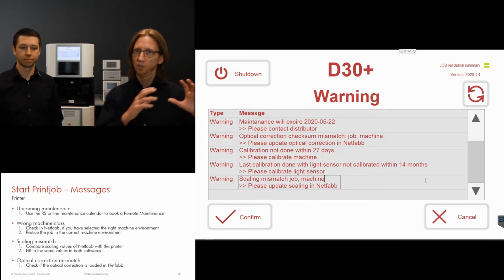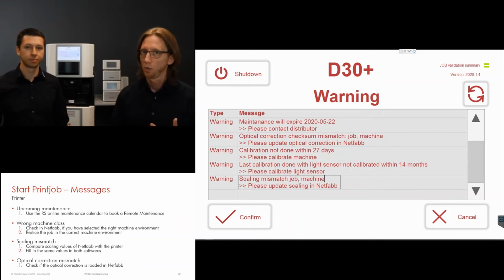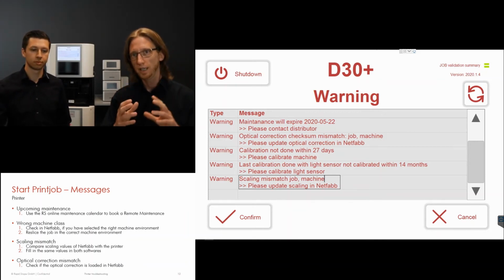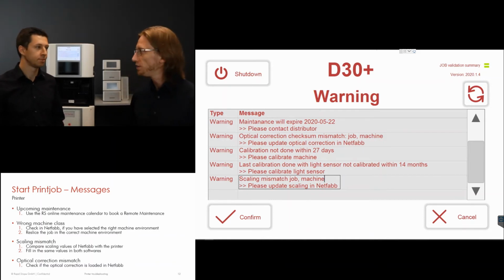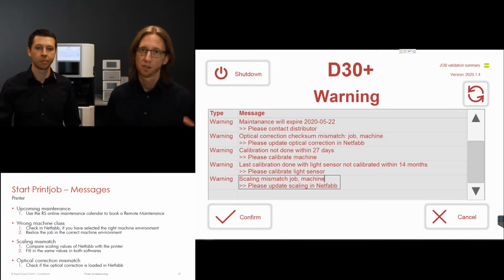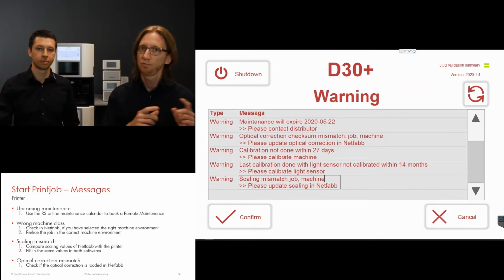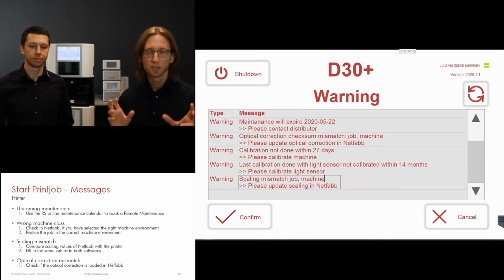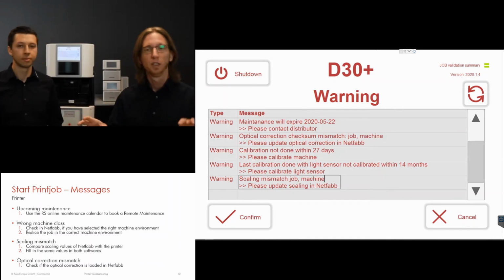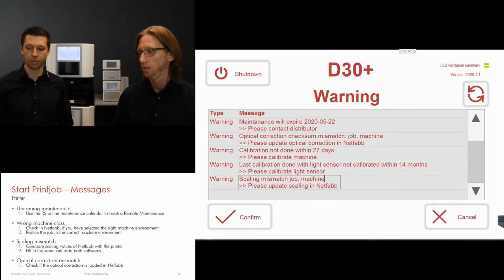As you all know, in a previous webinar we discussed the basic Netfabb settings. We put the scaling factors for X and Y in the Netfabb machine settings, and this information is also stored on the machine itself. Remember, when you log in as a supervisor, with the customer password, on the machine settings, you will also find this information. Again, the machine is just comparing the information which comes from Netfabb in the job information with what is stored on the machine itself. If this is not matching, we get the scaling mismatch.